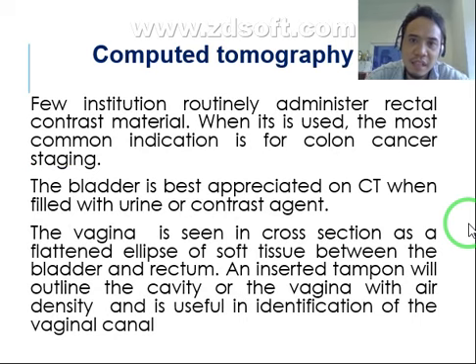Few institutions routinely administer rectal contrast material. When it is used, the most common indication is the colon cancer staging. Bladder is best appreciated on CT when it is filled with urine or contrast agent. So some institution uses or administer contrast agent or barium suspension rectal.